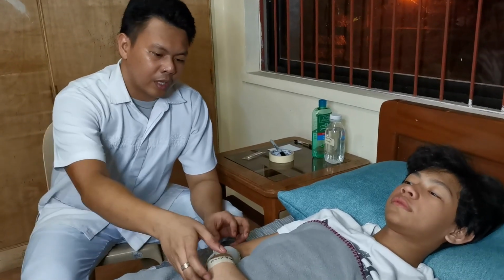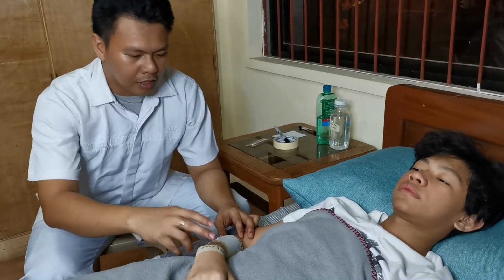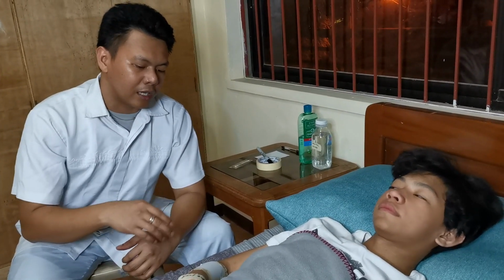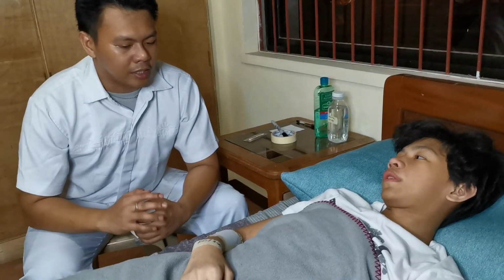Number 4, evaluate peri-wound skin integrity. This is done to assess the skin surrounding the wound because frequent application and removal of adhesives can cause damage to the surrounding tissue or skin of the wound. So, tanawan nato ang kilid sa imong samad, sir, ang panit sa kilid niya. So makita nimo nga okay man siya, wala siya na-damage. Kasagaran man gud kay medyo masamad siya tungod sa sige tanggal sa tape. So far, ang imuhang kamot okay raman, so walay samad.